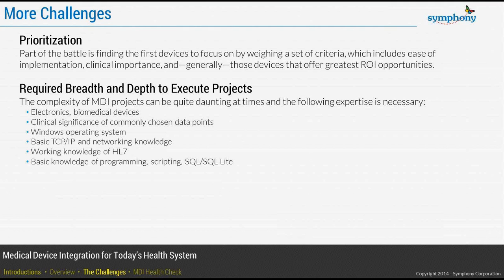Well, you need somebody with the clinical chops, so to speak, to help guide you through that. Sometimes it's a team, sometimes it's just a subject matter expert, like a physician or a CCU nurse, who guides you through that. Which heart rate do we want to put in here? Do we want them all, or do we only want 2? What's the difference between these, and so on and so forth.